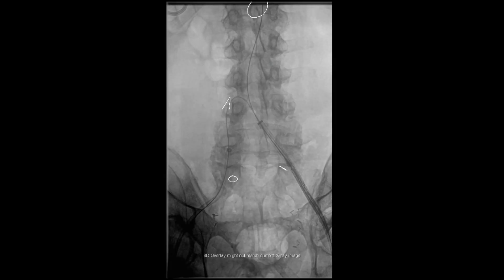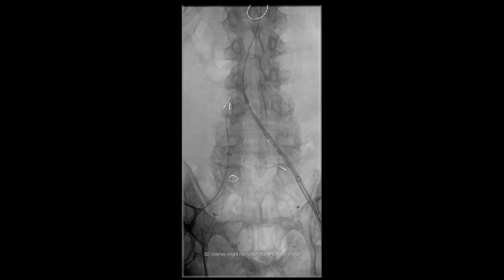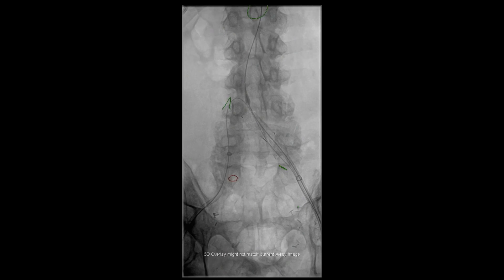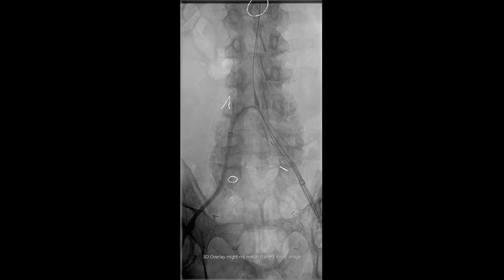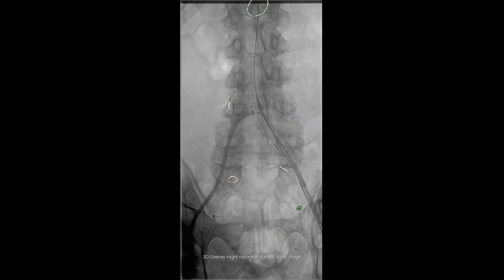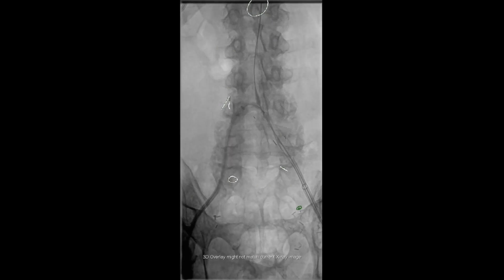We then introduced an iliac branch device from the left common femoral artery access site, and this is then partially deployed into the left common iliac artery. Next, a sheath is brought in from our right common femoral artery access site and then placed into this partially deployed iliac branch device into the left common iliac artery.